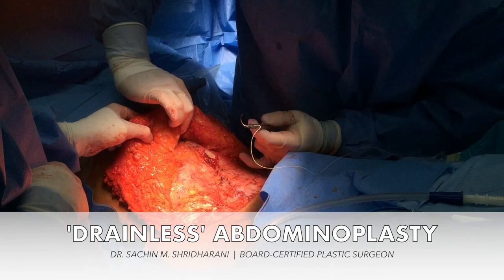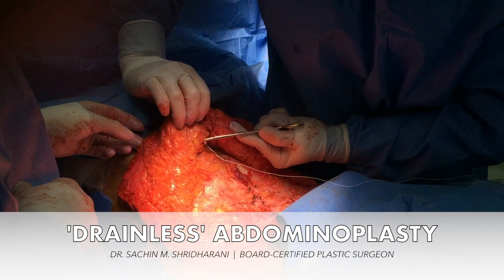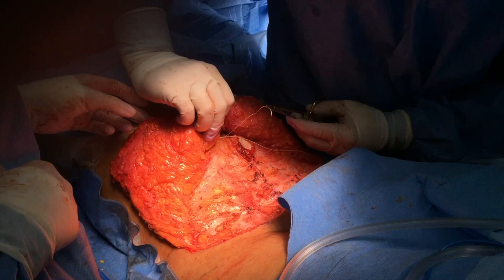I've already placed my most cranial or cephalad row and I'm basically looking at the next area that I want to advance my flap onto. Here I am just taking a nice healthy bite of Scarpa's fascia in through here with my stitch. I use my finger to basically see where I could safely advance that flap with a progressive tension technique.